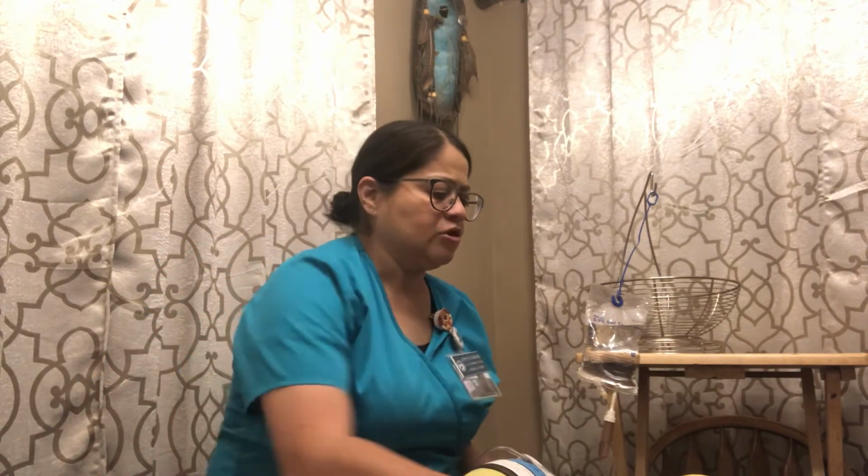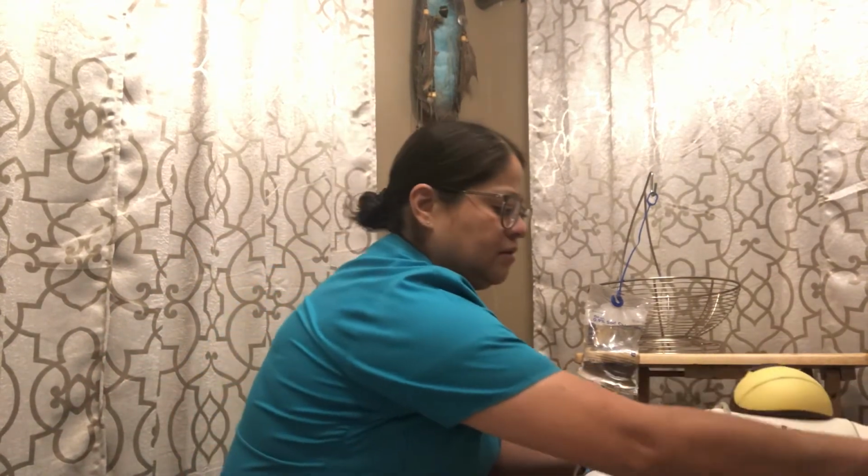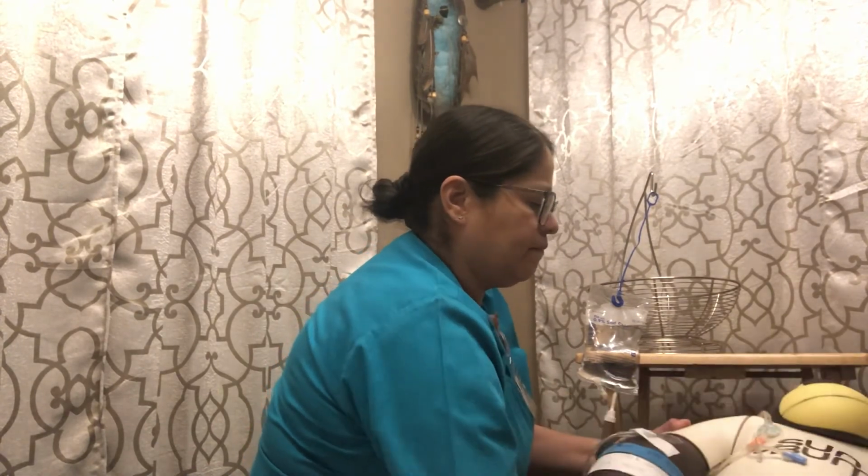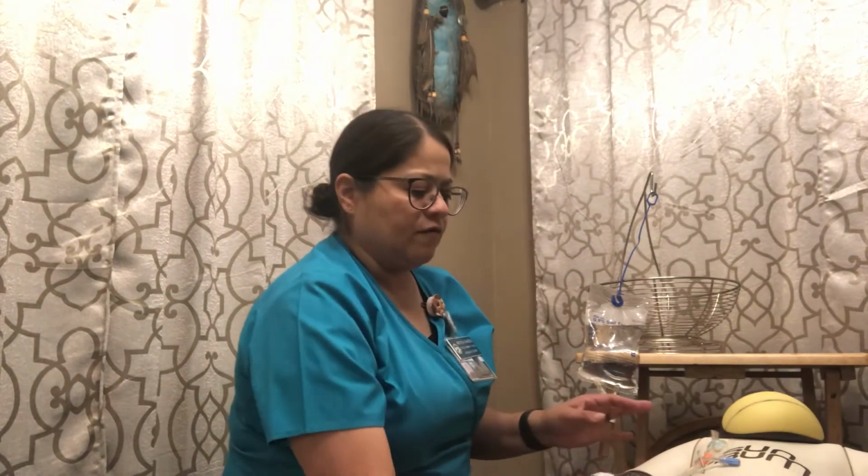So if the patient has a central venous access and we need to give a medication, the first thing we want to do is, the medication has already been drawn up in the medication room. I've done my 3 checks. I have my medication out here labeled and ready to go, along with the 2 flushes that I'm going to need for the injection. I've already washed my hands, identified the patient, pain level 6 out of 10, no allergies to medication.